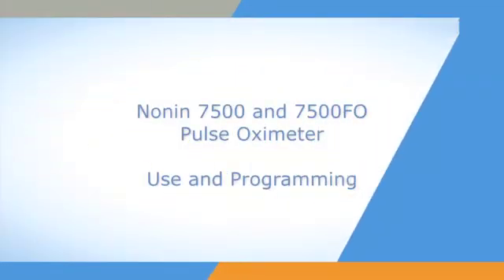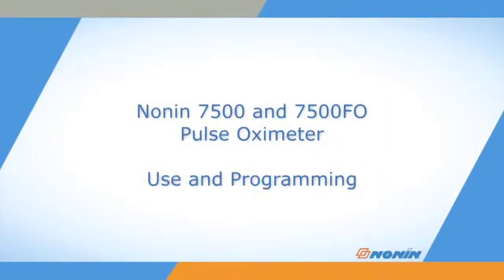This short video shows how to properly program, connect, and operate Nonin Model 7500 and 7500 FO pulse oximeters.